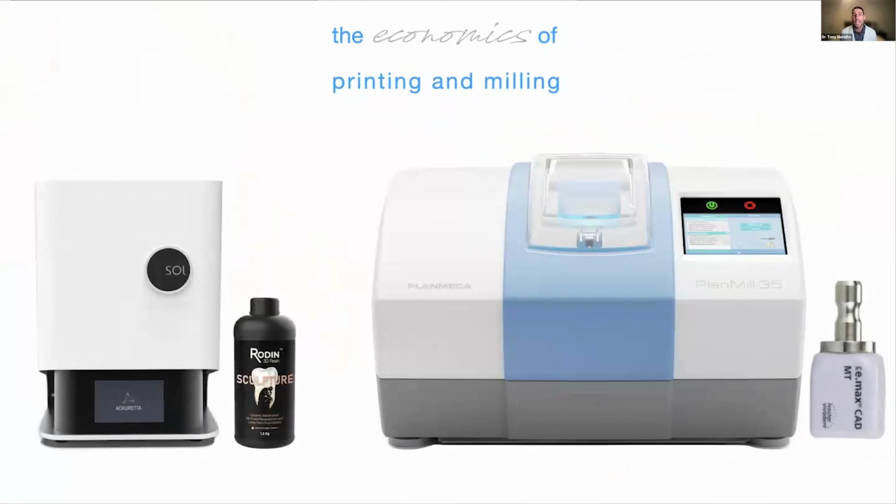So when we talk about the economics and we look at just the capital costs involved in purchasing these technologies, you'll find that printing is considerably less expensive than milling, right? In big round numbers, a mill is going to cost you 3 to 5 times more than a printing system. And when you look at the materials for those, pretty much the same numbers apply, though it does vary considerably from material to material.